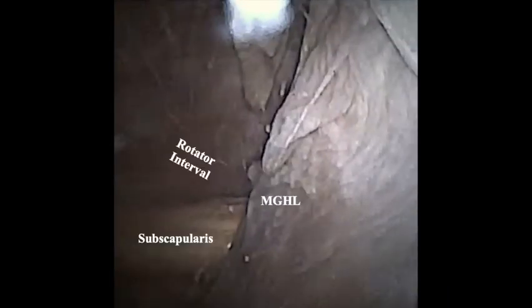Diagnostic arthroscopy is performed viewing the glenoid, the humeral head, the labrum, the long head of the biceps at its insertion, the rotator interval, including subscapularis and MGHL. The articular surface of the humeral head and the insertion of the rotator cuff are also assessed.